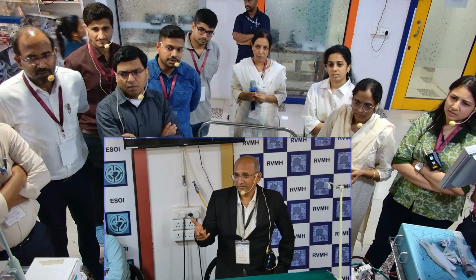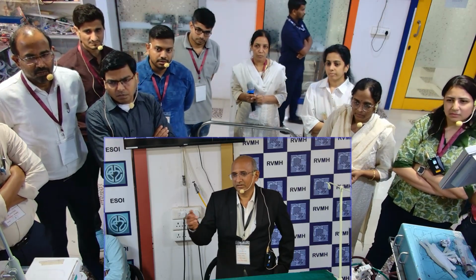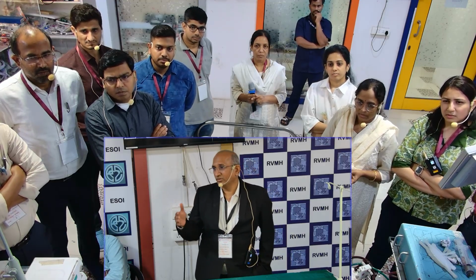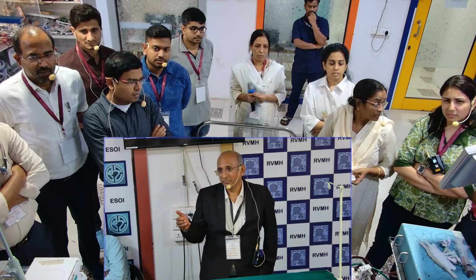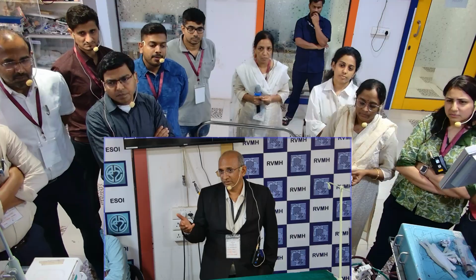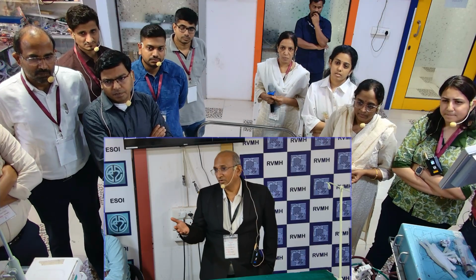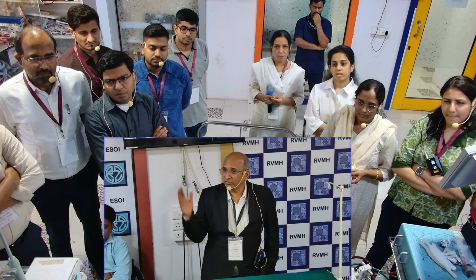Dark red means sweep gas failure, that is one. Second, oxygenator failure, but massive oxygenator failure usually is not present like this. Recirculation would give bright red. Third, blender failure. For dark red, methylene blue intoxication, or have you used methylene blue, or severe rhabdomyolysis? These are the differences. But in methylene blue and rhabdomyolysis, your saturation won't drop.